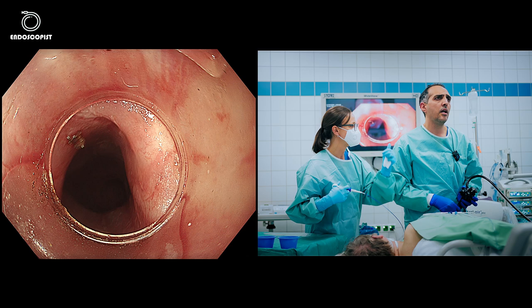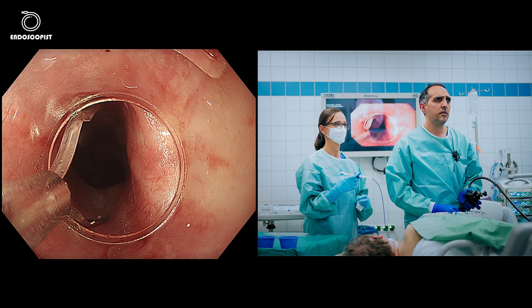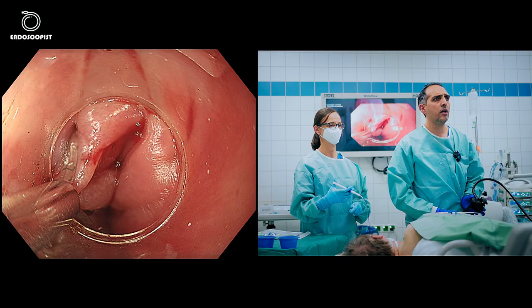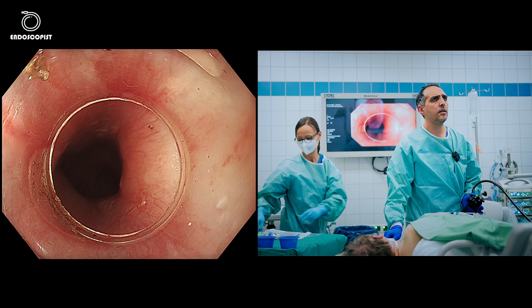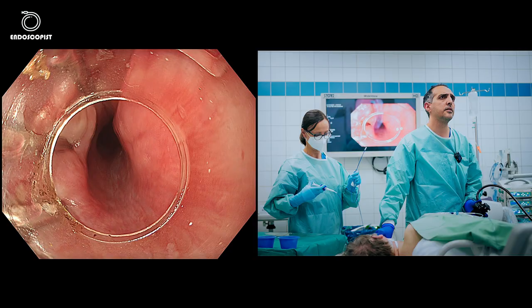I think I'll need one or two more clips. It's already closed but we'll add another clip for safety. I'm happy with how it looks. I'll give some insufflation — on the left side we have the pouch or diverticulum, and on the right side is the normal lumen. I'll give some water; it's quite open, looks nice, and the pouch is almost gone.